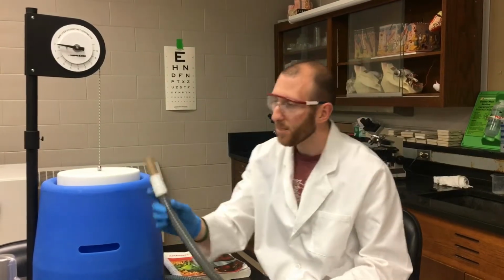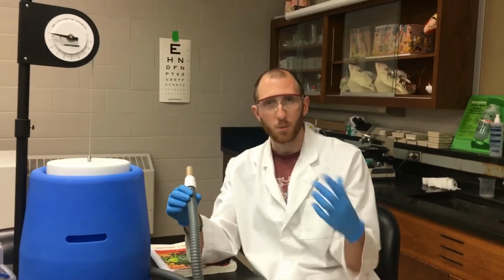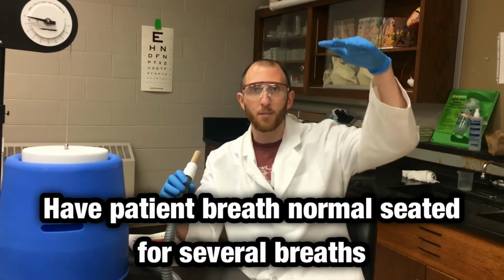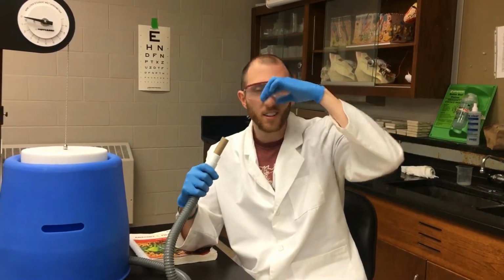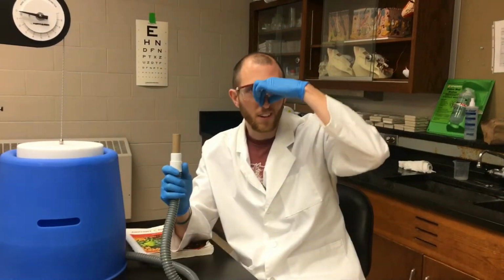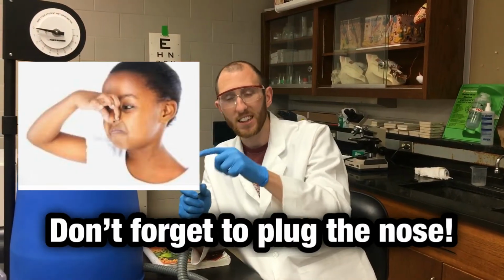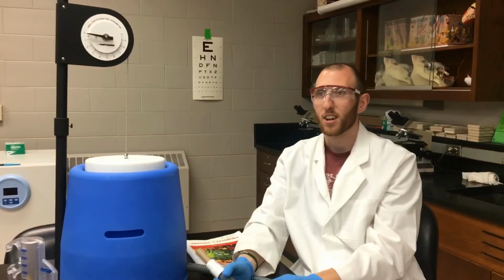So to measure that, what you want to do is have the patient sit down and breathe normally, nice and relaxed. And when they're at the top of an inhalation breath, you want them to plug their nose and exhale normally into this tube. Very important that they plug their nose, otherwise air might escape from their nose and not into the tube. So let's say I was sitting here just kind of breathing normally.